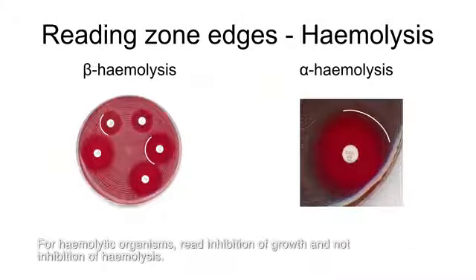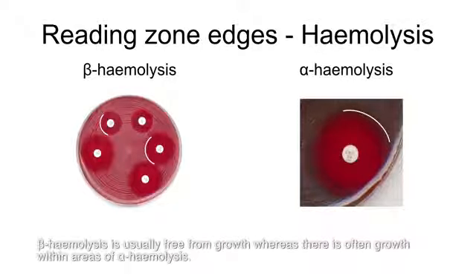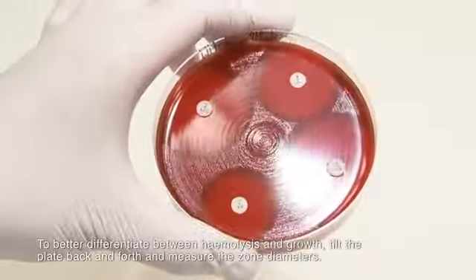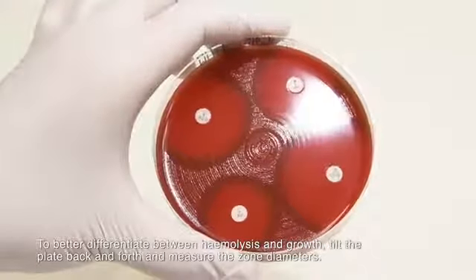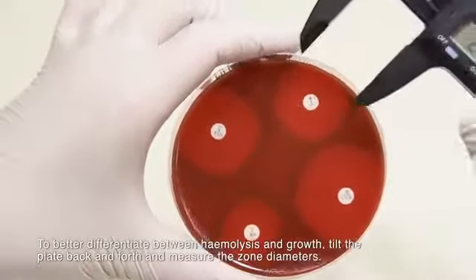For hemolytic organisms, read inhibition of growth and not inhibition of hemolysis. Beta hemolysis is usually free from growth, whereas there is often growth within areas of alpha hemolysis. To better differentiate between hemolysis and growth, tilt the plate back and forth and measure the zone diameter.